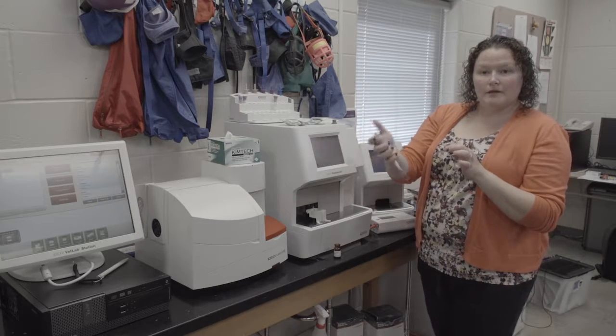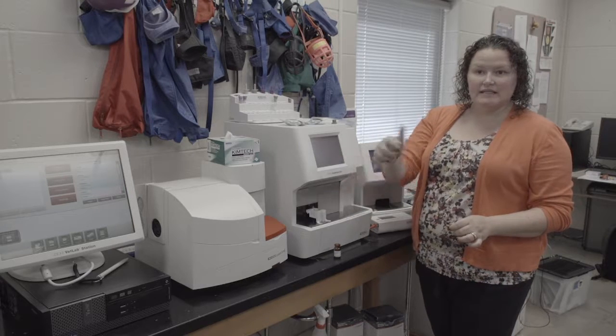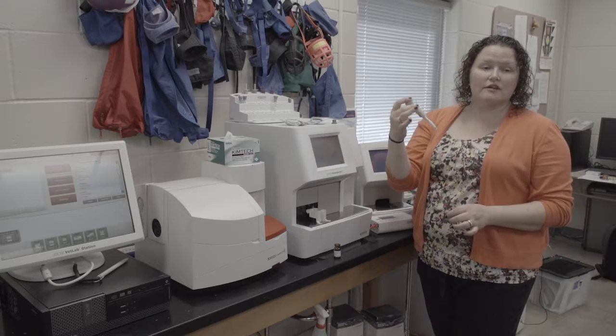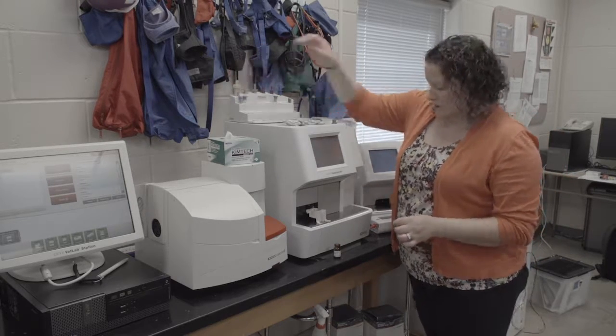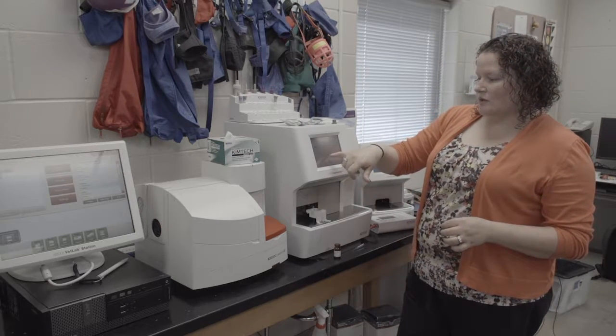Before I lay my pipetter down, best practice anytime you're using these is to remove your tip before you lay it down or turn it upside down. You don't want sample to run back into the pipetter because it can actually affect the accuracy of it. And that goes for any of these. So, lay that down. Now it's telling me to load a Lyte 4 clip and a QC clip.